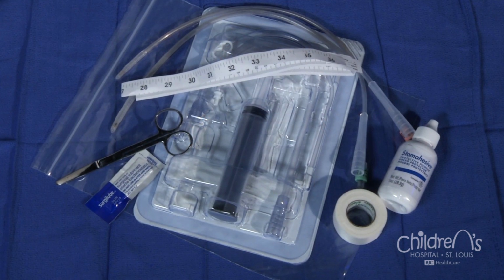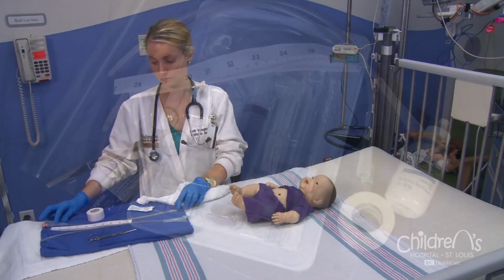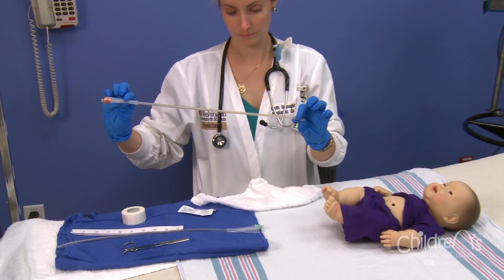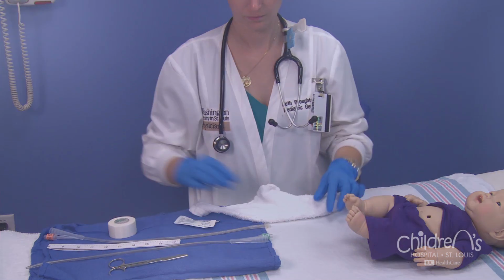Gastrostomy appliances, on very rare occasions, may come out. There is no immediate danger to your child. Formula or food may leak from the site, or you may see a small amount of bloody drainage. If your child's appliance comes out within 2 months of surgery or before the first gastrostomy change, you'll need to take several steps. You will be sent home with a take-home bag and 2 replacement tubes called Foley catheters. One is the same size French as the one found on the tube and one is a size smaller. Make sure to keep these items in a handy location.